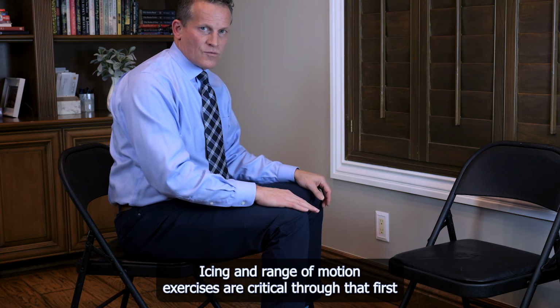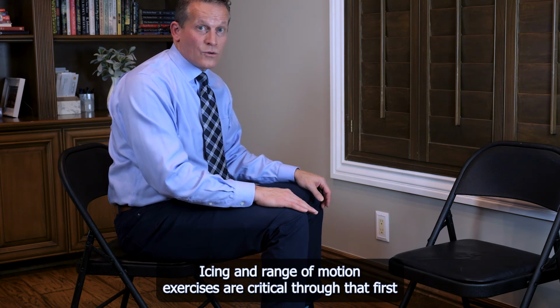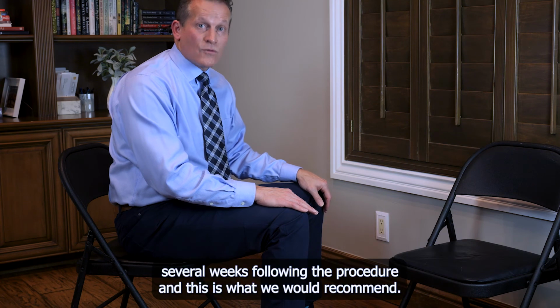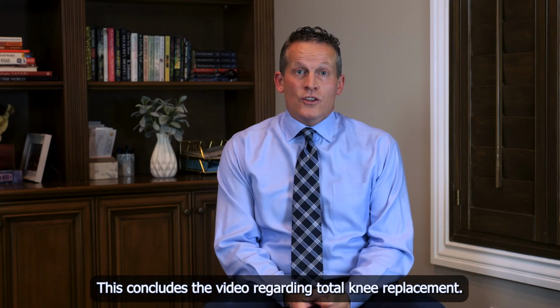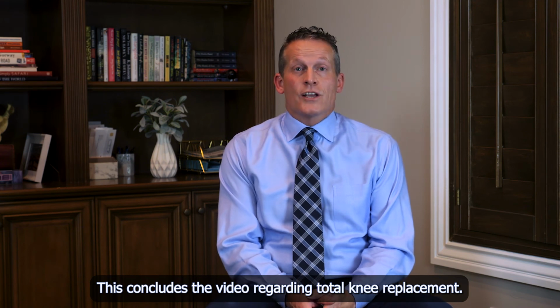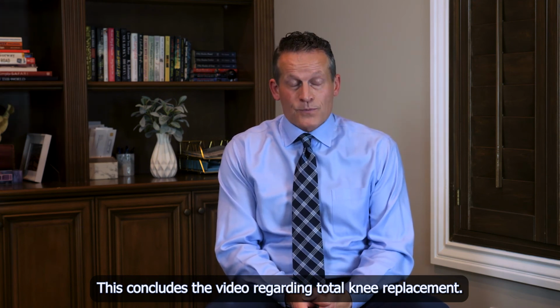Icing and range of motion exercises are critical through that first several weeks following the procedure, and this is what we would recommend. This concludes the video regarding total knee replacement.